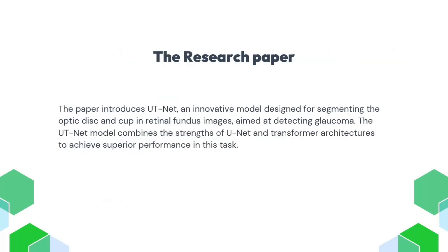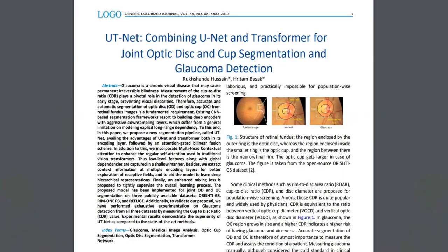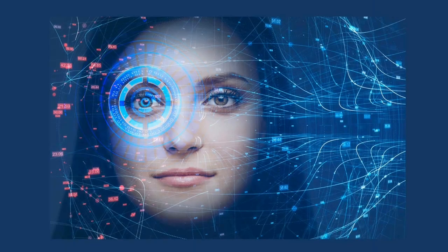In this research paper, the authors introduce a transformer-based model aimed at enhancing this segmentation process. The study addresses the critical need for reliable and generalizable segmentation methods in glaucoma diagnosis. Now that we are familiar with the problem statement, we can move to the next section, which is the dataset.